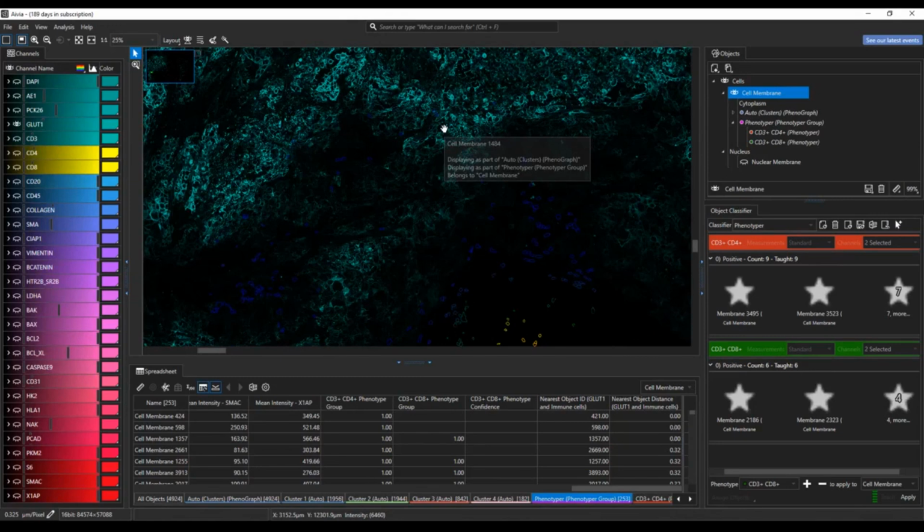But here you can see that the color code, we can set the relationship between these two types of cells and calculate the measurements between these two cell populations and phenotypes, and then also color-coded here in the image for an easier way to visualize that relationship.